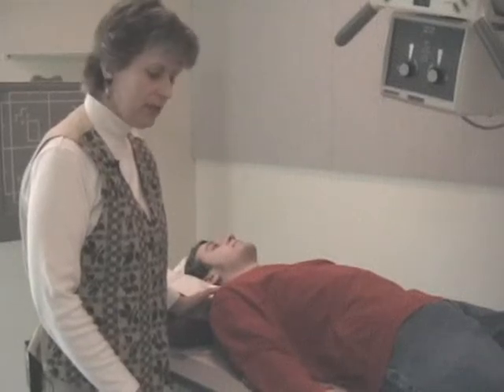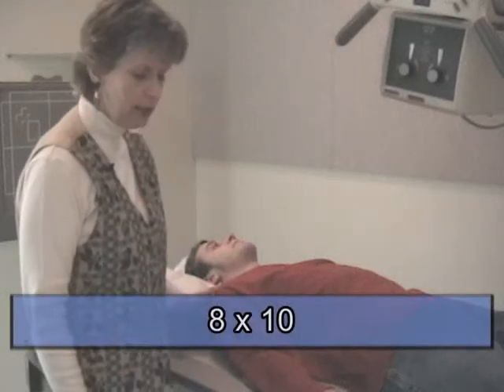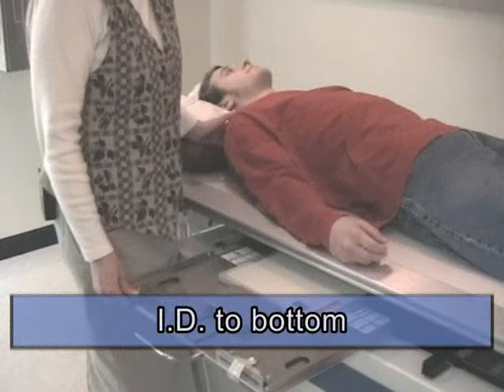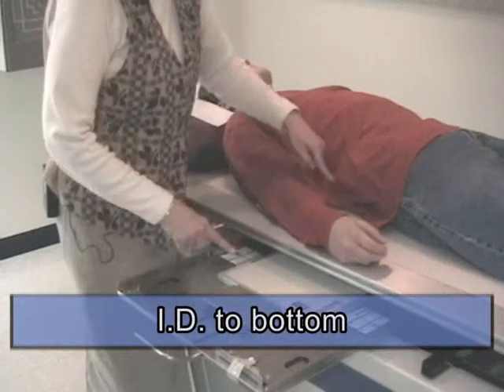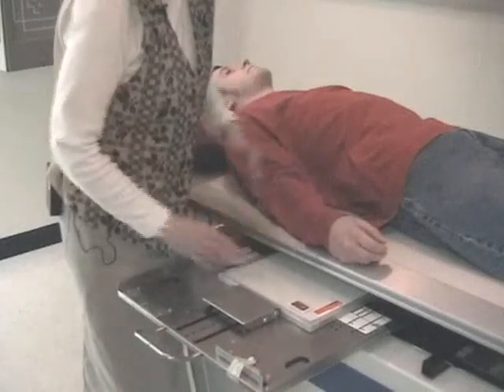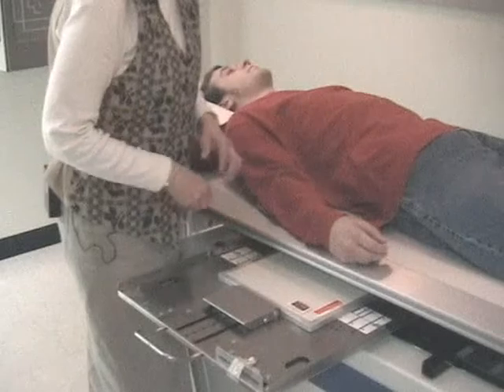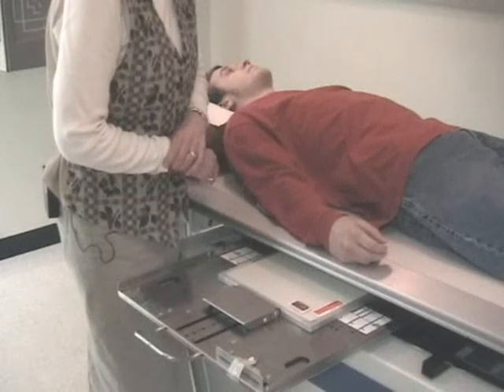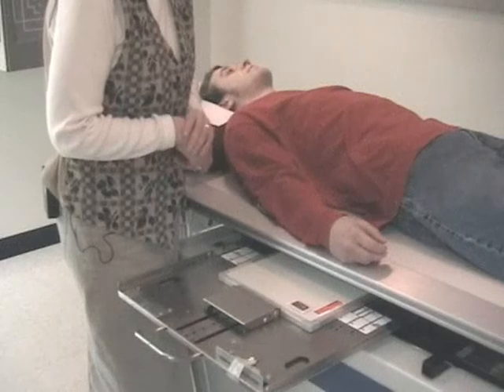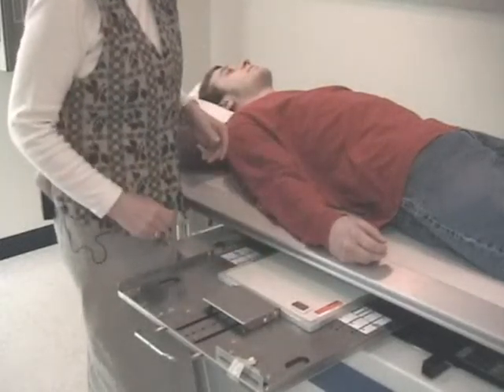I've set up for an AP sacrum now. We have an 8x10 in the bucky tray, lengthwise, ID to the bottom. Think of the shape of the sacrum. Its base is wider, and it goes to the apex in a V shape, and that's why we put markers to the bottom. The arm marker is moved in just a little bit because I'm going to have about a half inch, no more than an inch of collimation all the way around, again, to a lower corner because of the shape of the sacrum here.